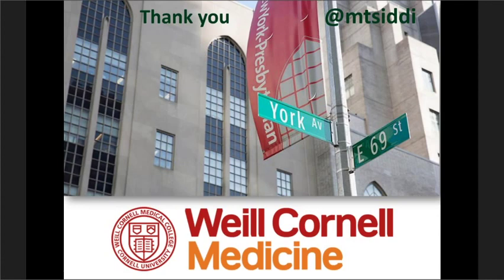One of the questions is, what are the criteria for an adequate sample? In other words, what is the adequacy criteria for pancreatic pathology? Good question, Guliz. Thank you. If we are dealing with a malignancy that's suspected based on radiologic considerations, then look for at least, I would say, 100 cells on your Diff-Quik stain at the time of adequacy assessment. I think that really is a good metric.